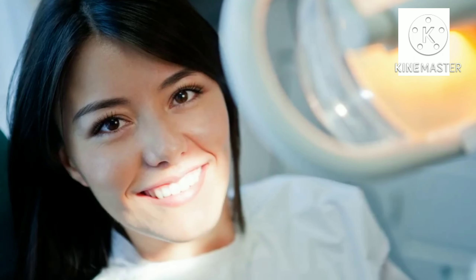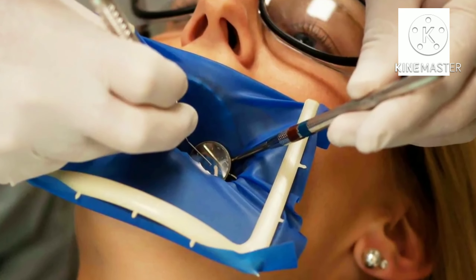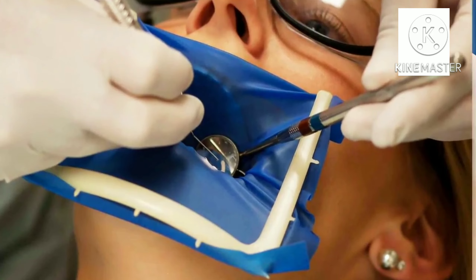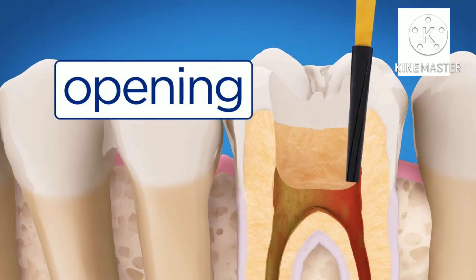First, your endodontist will numb the tooth so that you won't feel anything during the procedure. A small shield isolates the tooth, keeping it dry and clean. An opening is made through the crown of the tooth and into the pulp chamber.